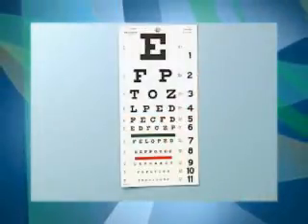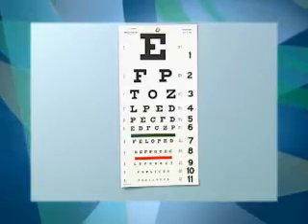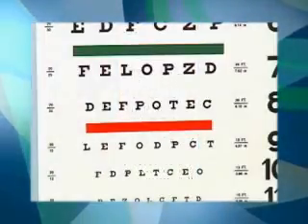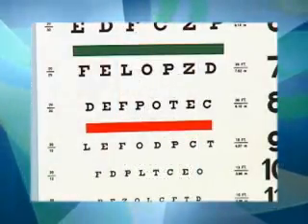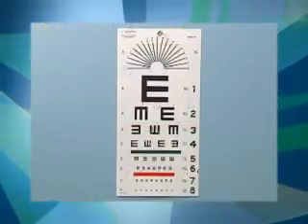The medical assistant performs a distance visual acuity test to screen for the presence of myopia or nearsightedness. The Snellen eye chart is used the most often in the medical office to assess visual acuity. School-age children and adults are tested using a chart that consists of letters in decreasing sizes.